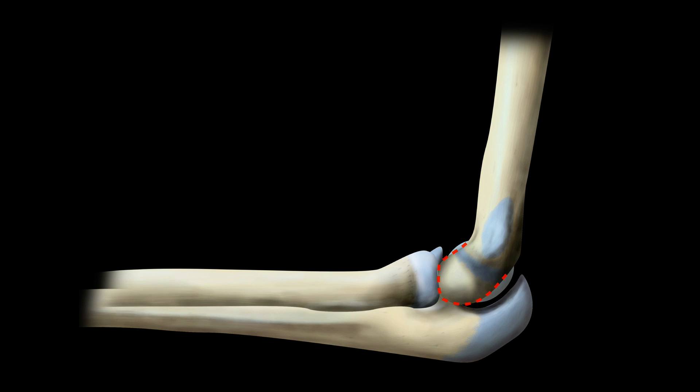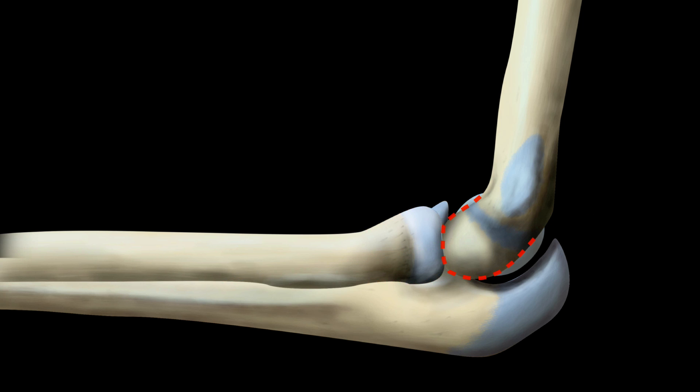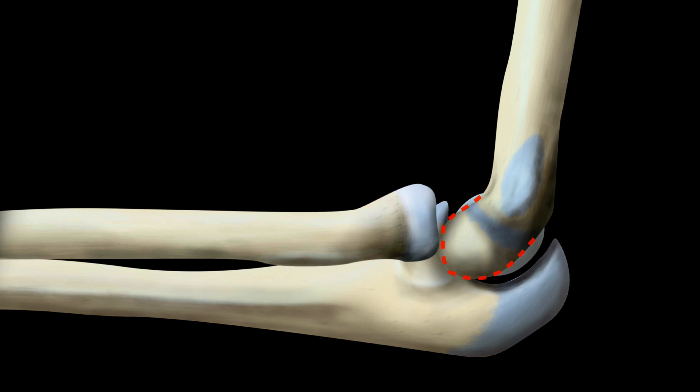The other line, and the one that is key to diagnosing radial head dislocation, is the radiocapitellar line. On all views, if you draw a line along the radial neck it should intersect the capitellum. If you dislocate your radial head, the line drawn down the neck of the radius doesn't intersect the capitellum. However, it's important to draw the line accurately. If you draw it along the radial shaft, the line may still intersect the capitellum if the dislocation is subtle.